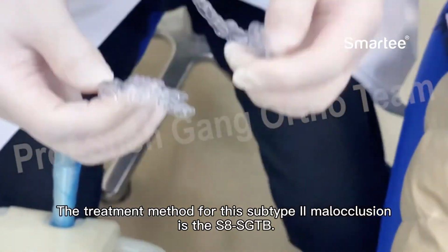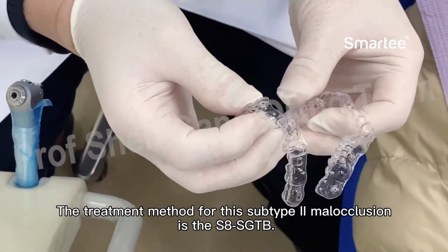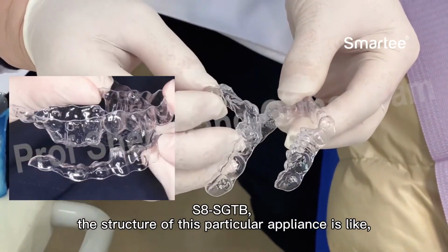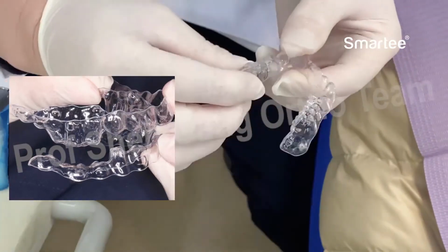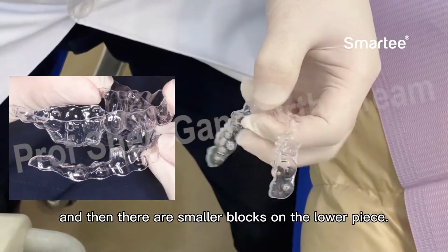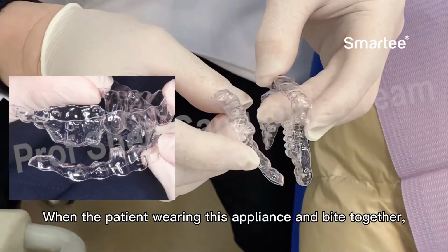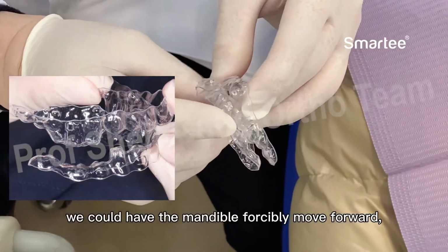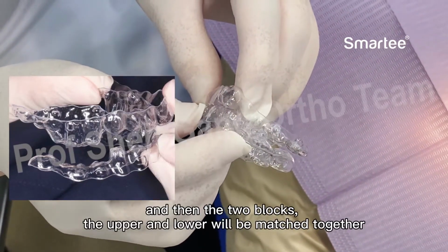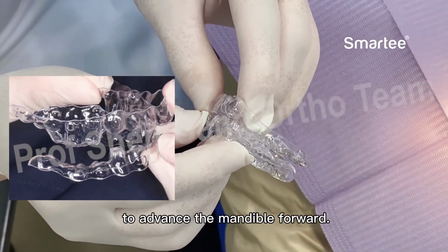The treatment method for this subtype 2 malocclusion is the S8 SGTB. The structure of this particular appliance is like this: we have an occlusal splint in the upper piece of the appliance, and then we have smaller blocks in the lower piece. When the patient wears this appliance and bites together, we could have the mandible forcibly move forward, and then the upper and the lower blocks will be matched together to advance the mandible forward.